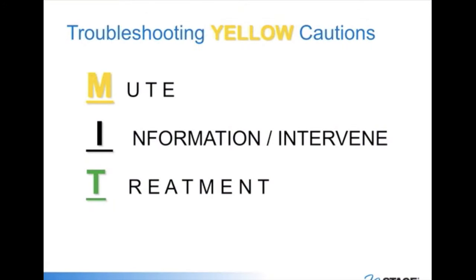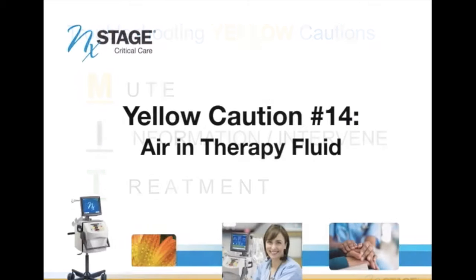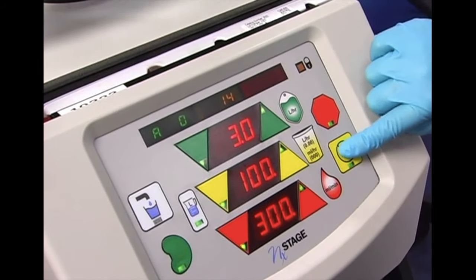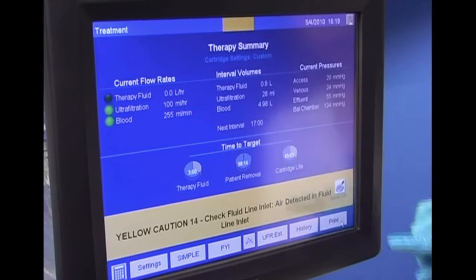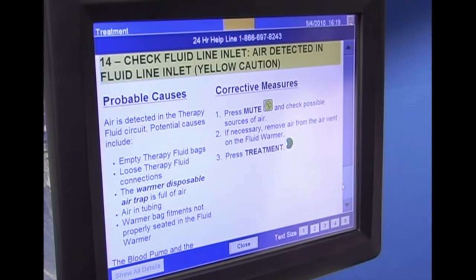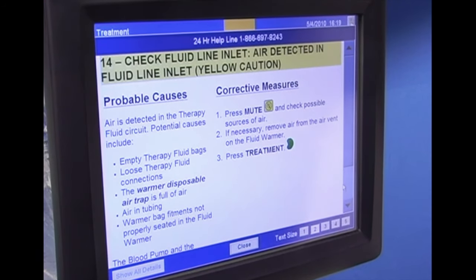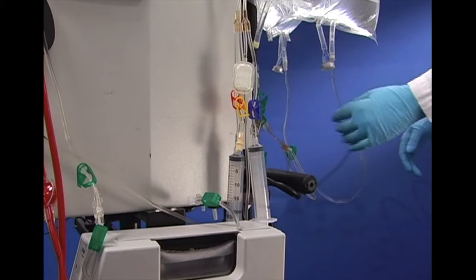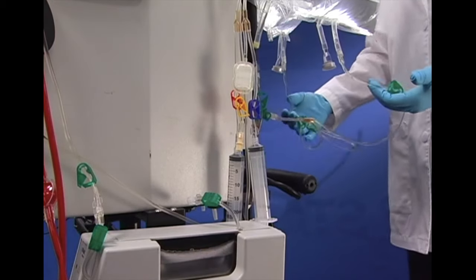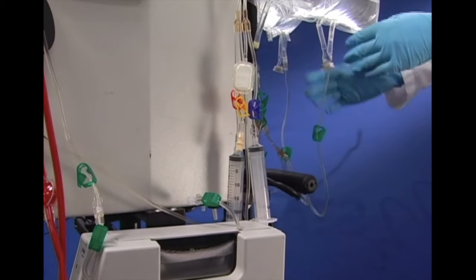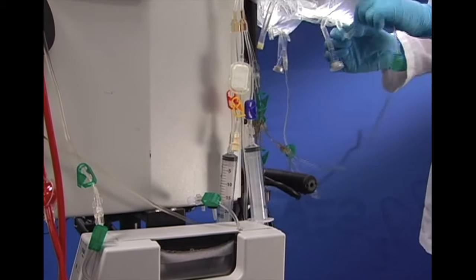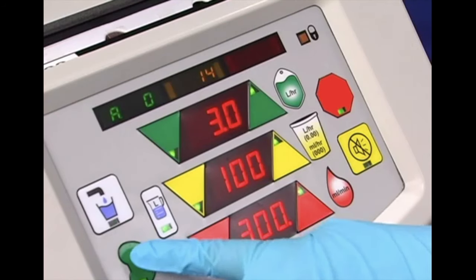Use the acronym MIT to resolve a yellow caution: Mute, Information, Treatment. Let's review yellow caution number 14. Press mute. Click the more information icon. In this example, the caution indicates that there is air in the therapy fluid or an occlusion in the therapy fluid line. Check possible sources of air or occlusion and correct them. If necessary, remove the air from the air vent on the optional fluid warmer. Press Treatment.